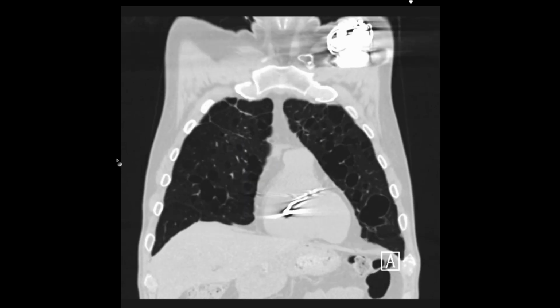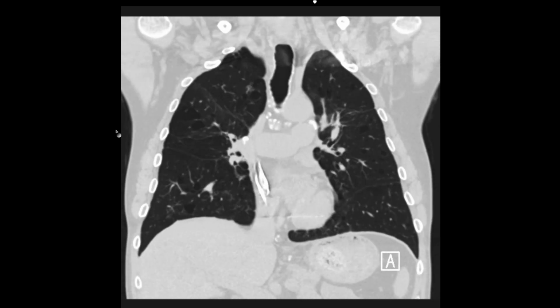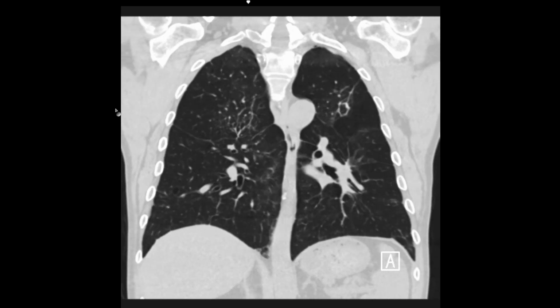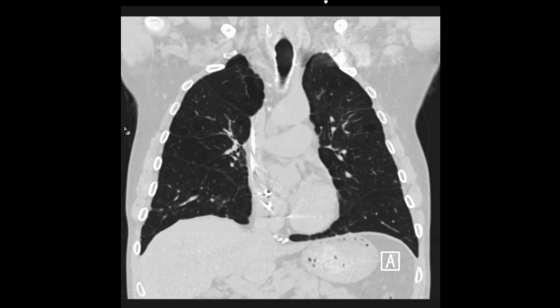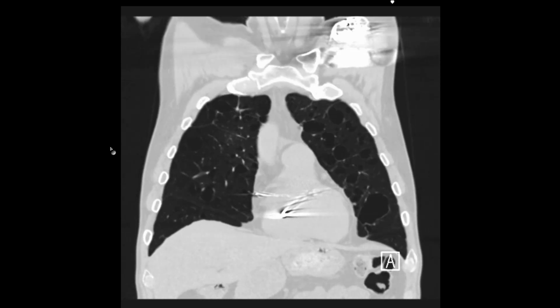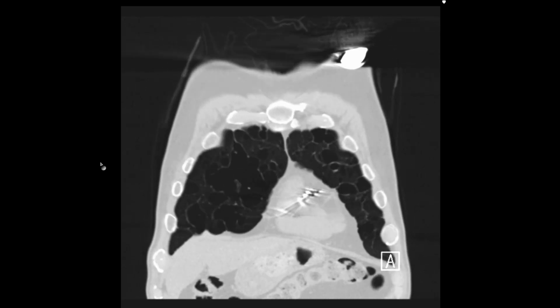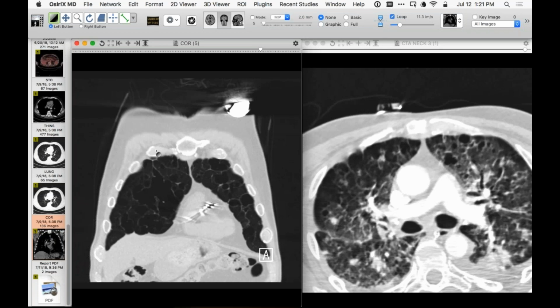Let's look at that. The lung in between looks okay. People have looked at HIV in him, right? Have you been checked out? They did. Not HIV positive. The pneumocystis was negative. The only thing that came up and eventually was culture positive was the cocci. Amazing. So I was floored by that. I really was. That is so impressive. So if it's not that, I don't know what it is, but there's a lot of circumstantial evidence to indicate that seems to be what it is.